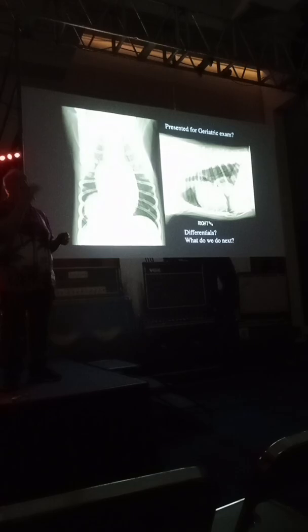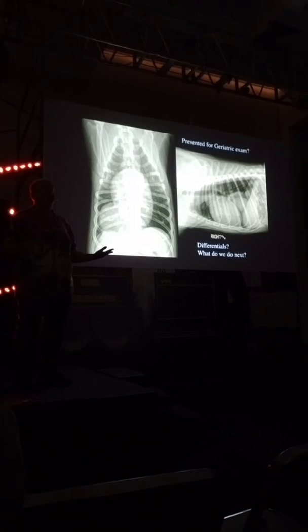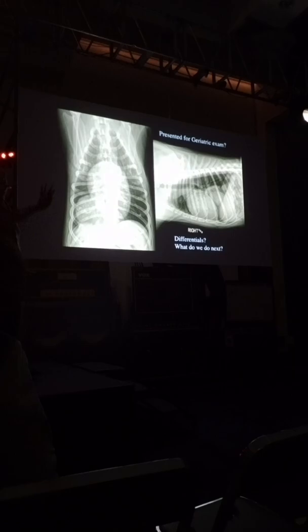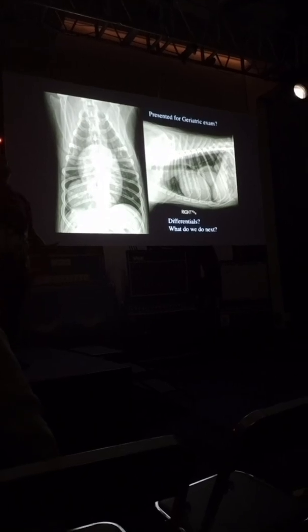How many people are willing to bet me that you believe it's a lung lobe mass easily, and I'll bet you it's not? How many people are confident? I'll bet you 20 pesos. What's that, $1? No, I'm not betting you. I don't want to take your hard-earned money. Diaphragmatic hernia. Somebody says diaphragmatic hernia.